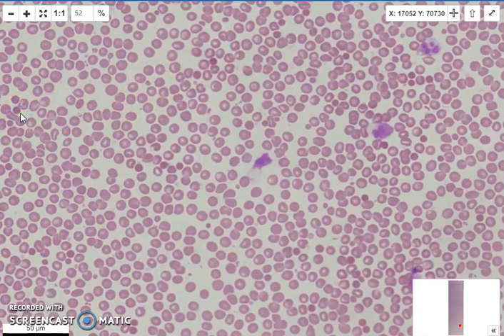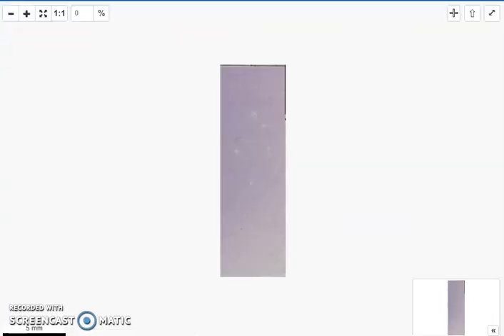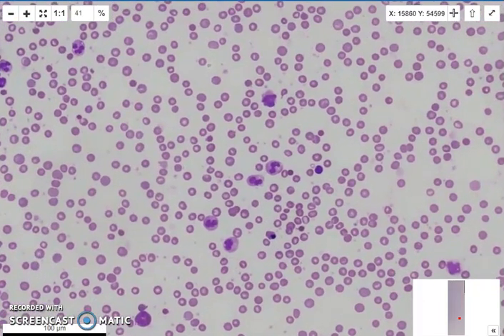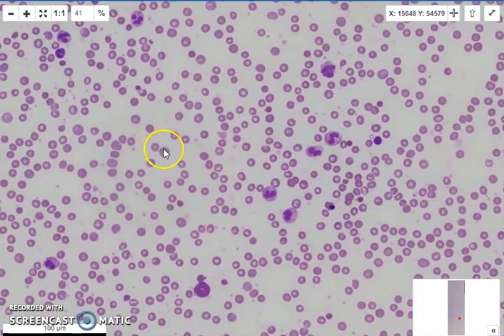Now, something that I do see happen often is students get spherocytes and bite and blister cells confused. So I'm just going to spend the last few minutes looking at bite and blister cells and G6PD deficiency. Okay. So again, we know we have a real acute hemolysis. I have quite marked polychromasia and a reticulocyte response. I have nucleated red blood cells. And so I'm looking for those nasty red cells.